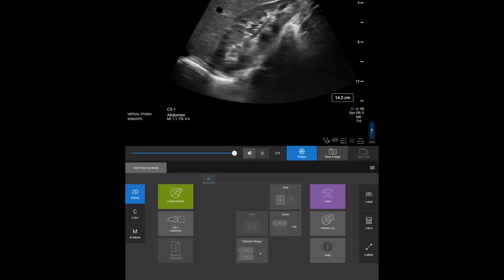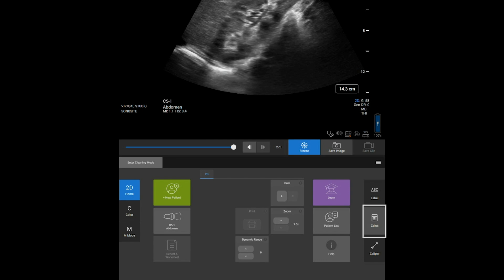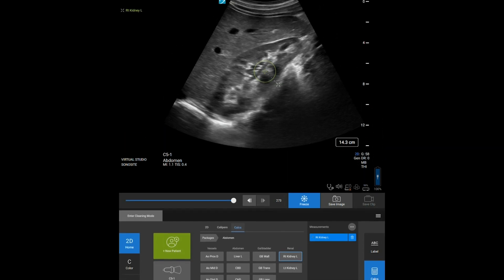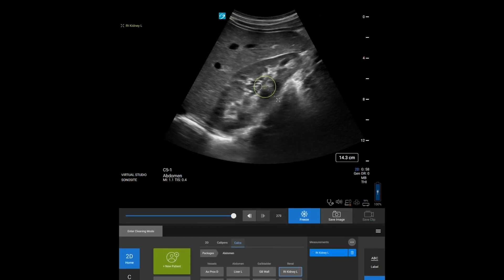While measuring, press the calcs control and select a calculation package, then the measurement you want. You may need to navigate multiple menus to find the measurement that you want. Use the calipers to make your measurement. The measurements are automatically saved to the patient report.